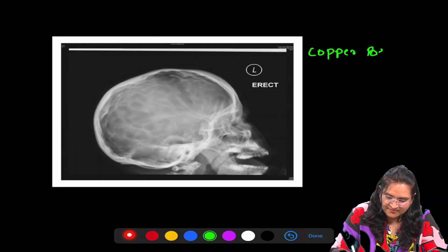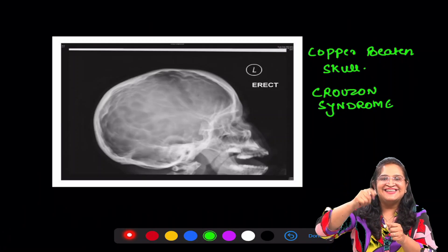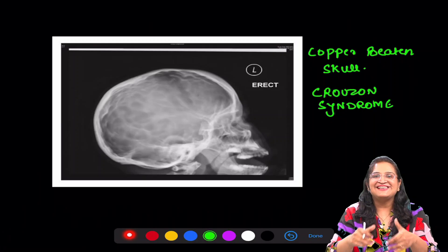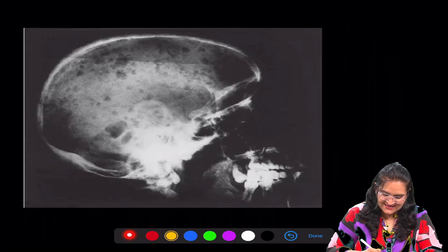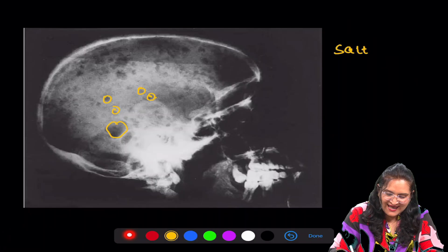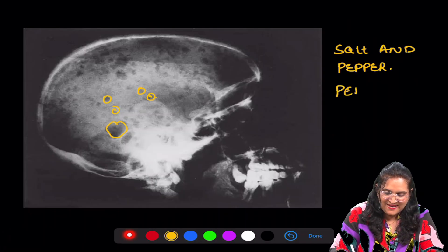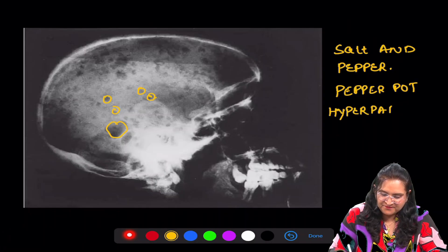The next radiograph is copper beaten skull, and this we see in Crouzon syndrome. Doesn't this look as if someone has taken a hammer and beaten the skull? Next is the radiograph where we see salt and pepper appearance, also called pepper pot skull, and this is showing hyperparathyroidism.